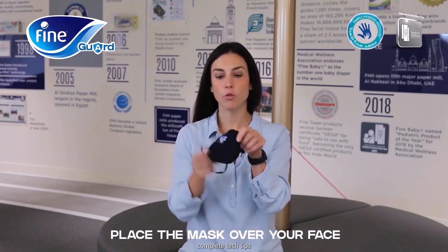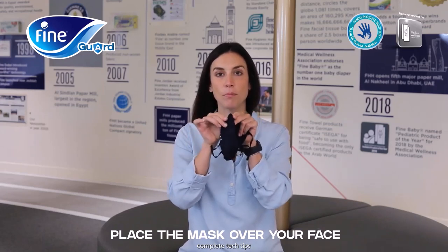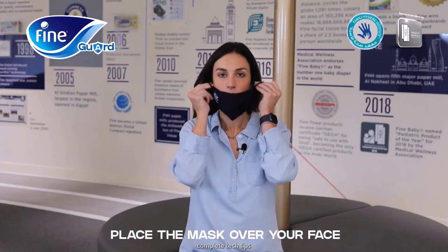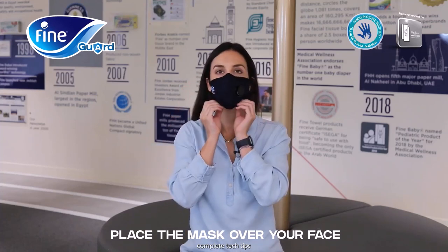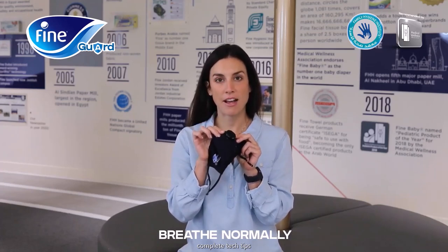A lot of people get confused about which way to place it. You're going to feel an adjustable metal piece and place it over your face like this. Here you have the valve, which helps you breathe nicely in and out of the mask.